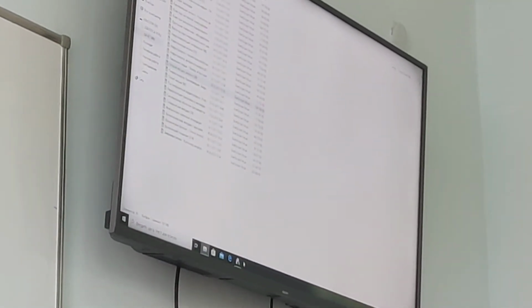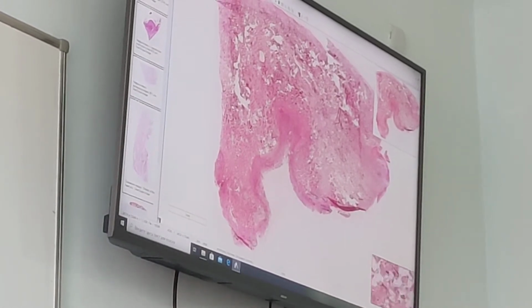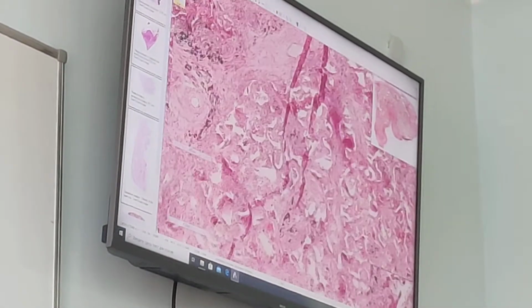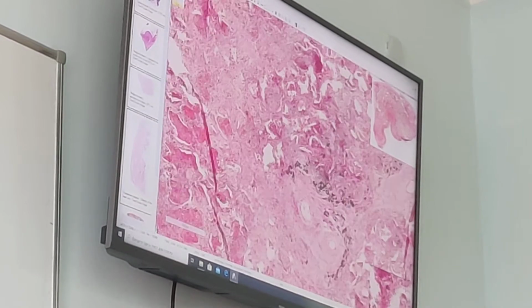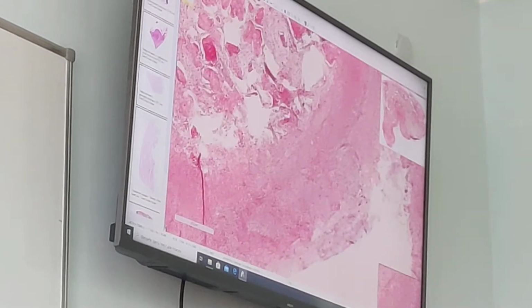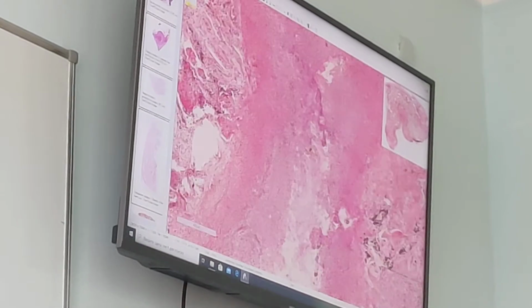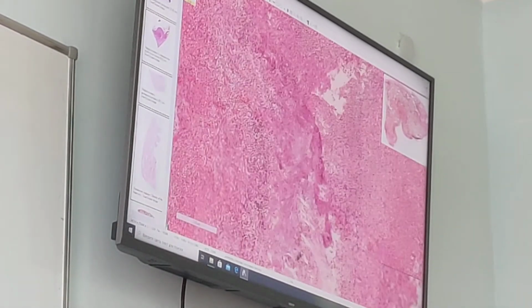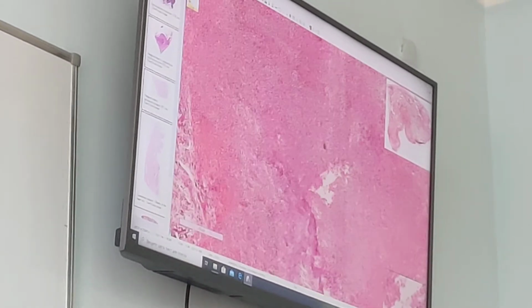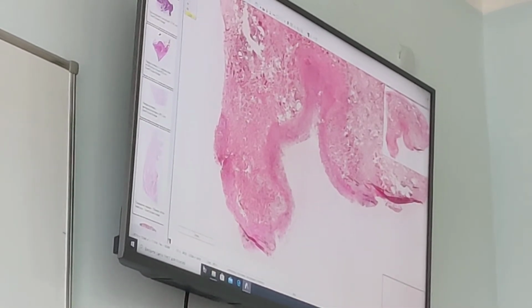Acute abscess of the lung, complication of pneumonias, fragment of the lung, hematoxylin and eosin stain. In the peripheral part of the lung, we can detect alveoli filled with pus, with purulent exudate. And in the central and lower part, abscess. Abscess is acute, so we can see the wall consisting of one layer, pyogenic membrane, granulation tissue. Inside the lumen, neutrophils. Multiple neutrophils can be seen. This is acute abscess of the lung.